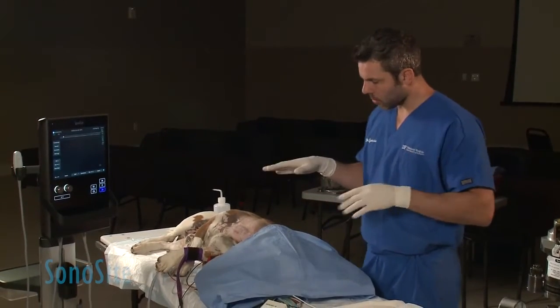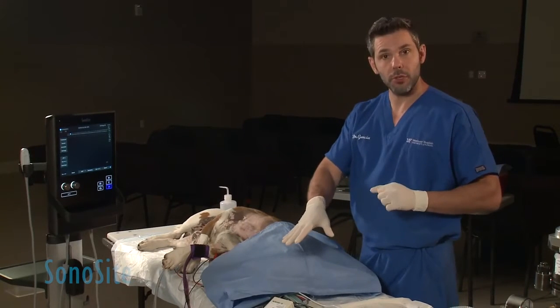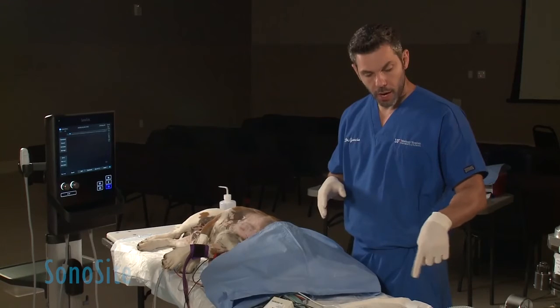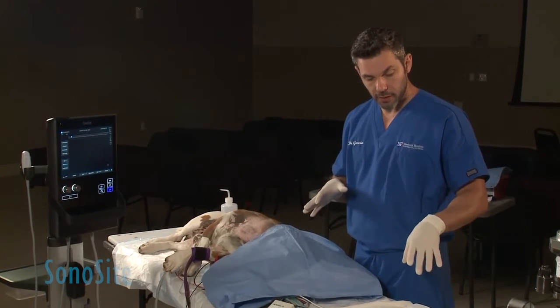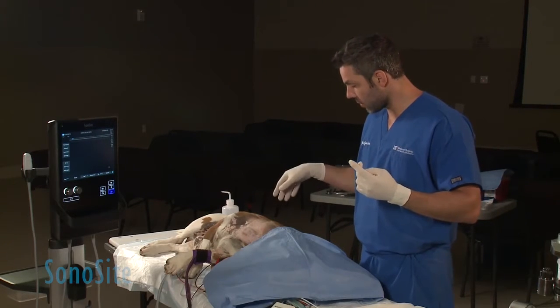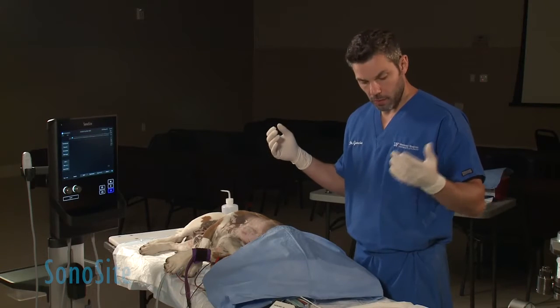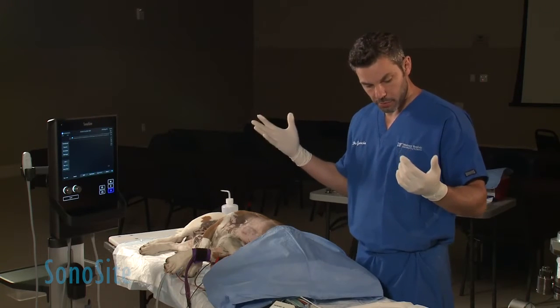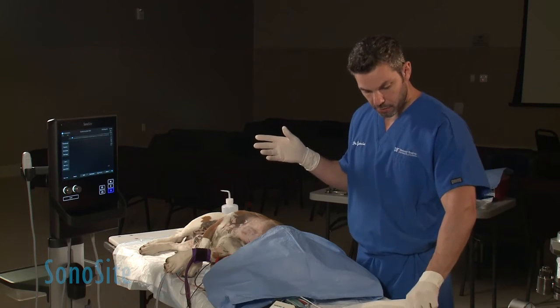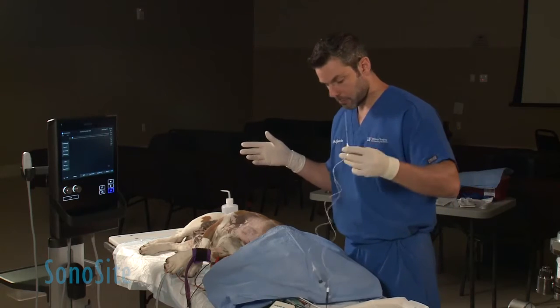I have scrubbed the area that we're going to be blocking. The animal is connected to my needle stimulator at 0.7 milliamps. My needle is already primed with the local anesthetic. I don't want to inject any air. I have sterile gloves on. The ultrasound is not covered, so my right hand is going to be unsterile — I will try to avoid touching my needle with this hand. Only my left hand is going to be touching my sterile needle.